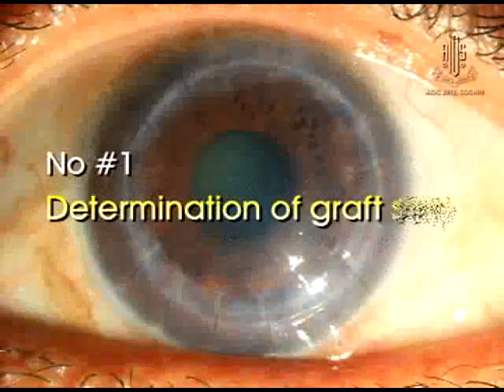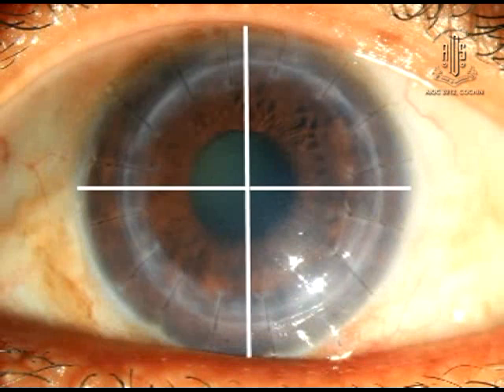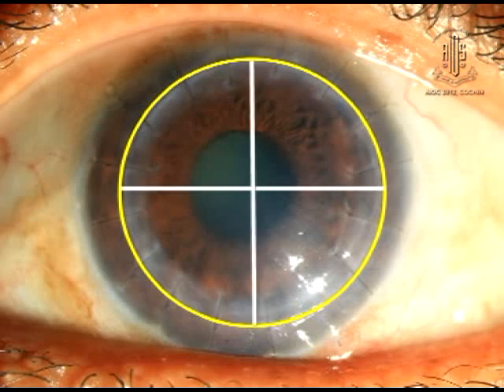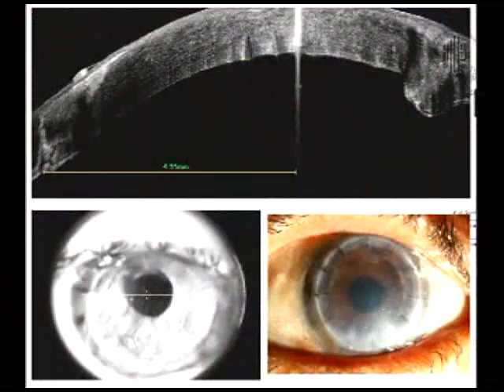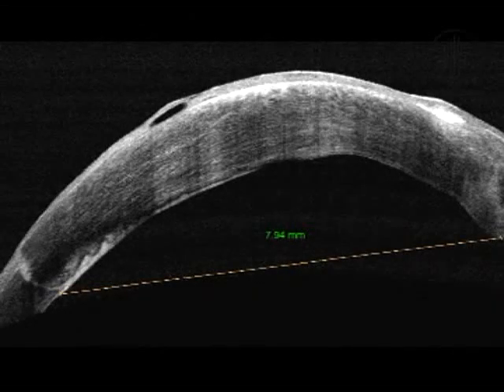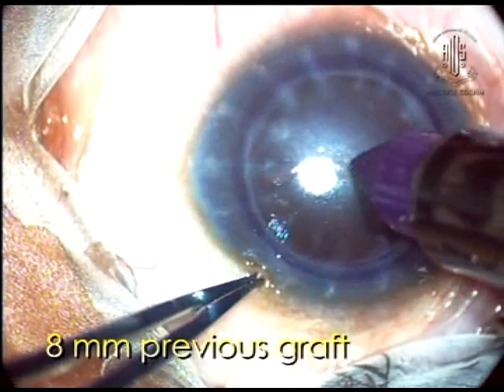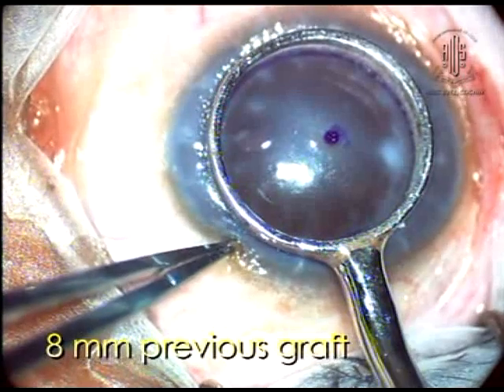Number 1. Determination of donor size. Overall corneal diameter, previous graft diameter, and a preoperative anterior segment OCT is a must. Normally, the teaching is to use DSAEK donor tissue with a diameter less than or equal to the previous PK graft. If the OCT picture shows smooth posterior surface and the previous graft is around 8 mm, use same size donor tissue.